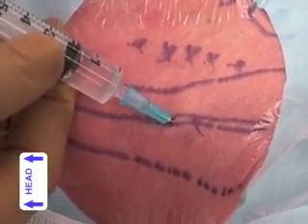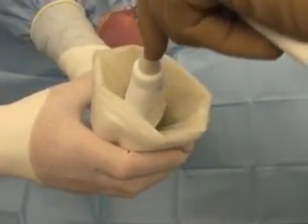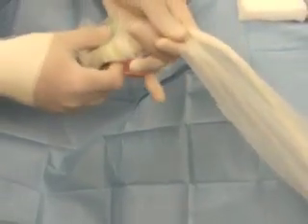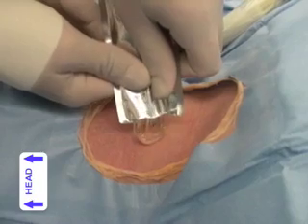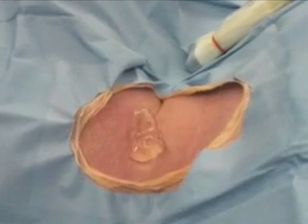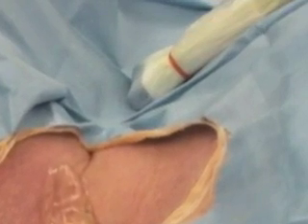Lidocaine should also be used for sedated patients in the intensive care unit. To prepare the ultrasound probe, have the assistant dispense enough acoustic gel into a sterile transducer sheath to cover the transducer surface inside the sheath. Have the assistant carefully feed the probe into the sheath and through the gel, while extending the sterile sheath away from you over the length of the probe wire. Eliminate any wrinkles in the sheath and any air bubbles between the transducer and the sheath, then secure the sheath using sterile rubber bands or plastic clips. Apply a small amount of sterile ultrasound gel to the covered probe or to the patient's skin to complete acoustic coupling, and identify a convenient sterile area on which the probe can be placed when not in use.